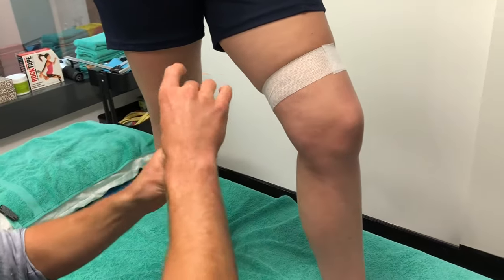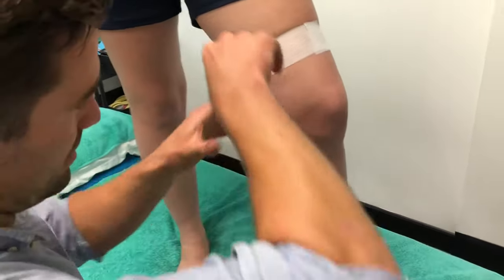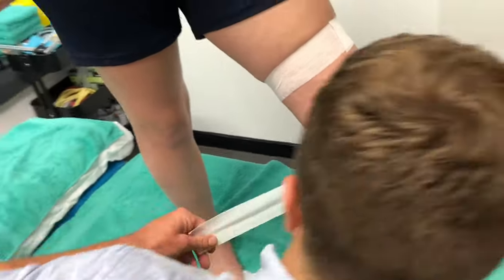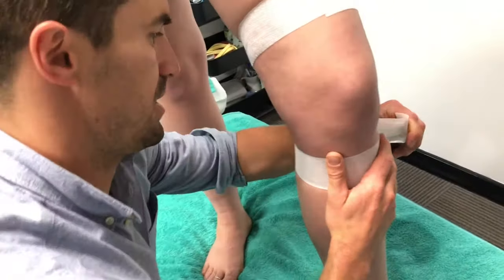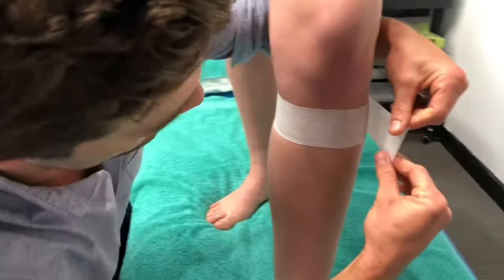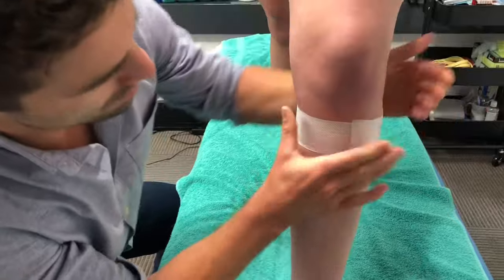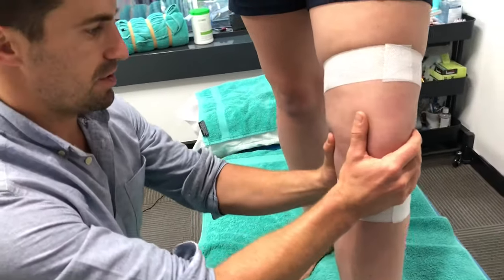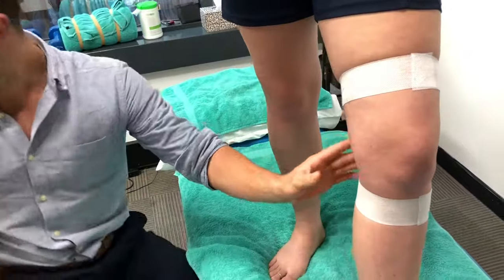You're just aiming right for the top of the tibia here — just that hard bony part. Pull that across there, same thing firm, but it doesn't need to be too tight. You want to make sure that they've just got a slight bend in their knee for when you do the next bit.